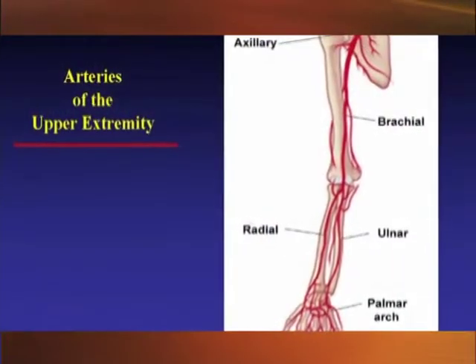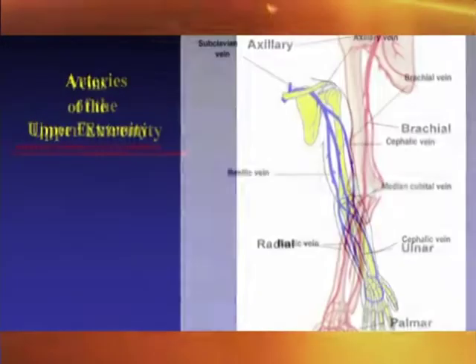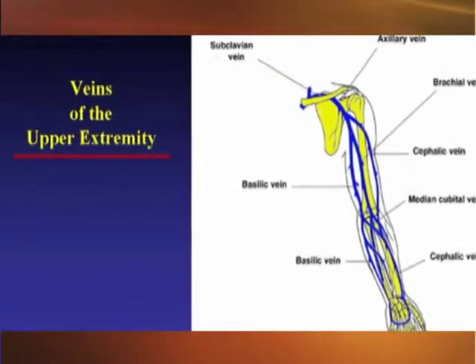A vein mapping is necessary so that we can give the surgeon recommendations as to where the fistula should be placed. The purpose of the study is to map out your veins and arteries before the surgeon performs the operation. The chances of a successful fistula are much higher by having the vein mapping done. Many times when a fistula does not work, it is because the vein mapping was not done before the surgery.